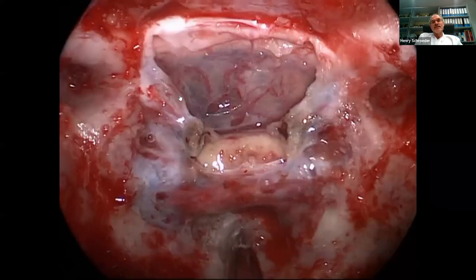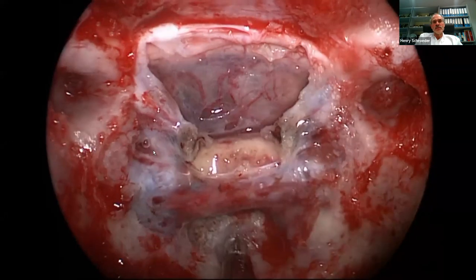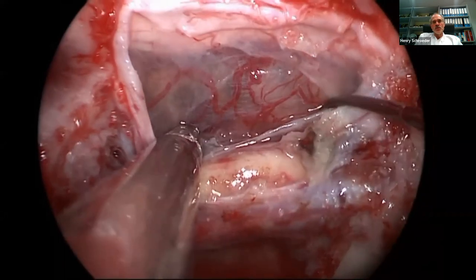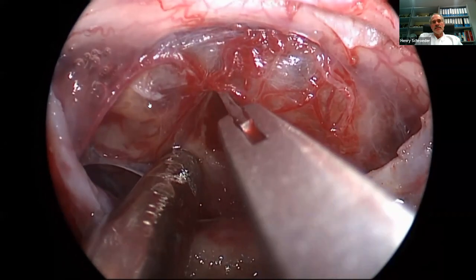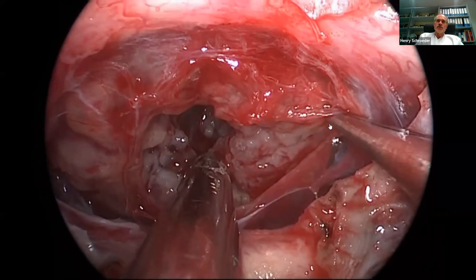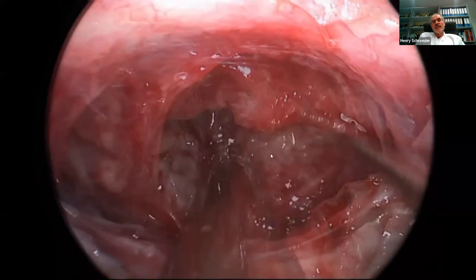So we make an endonasal approach. Here's a left optic nerve, right optic nerve. Here's a carotid, pituitary gland. Dura already open. You see here branches of the superior hypophyseal artery. These should be preserved. So we open the infundibulum. This is no tumor capsule. This is all normal infundibulum, and the tumor is inside. So finding the right plane is of utmost importance, as usual in neurosurgery.